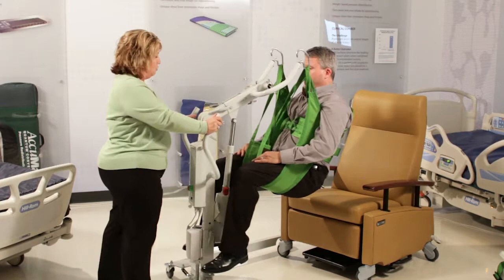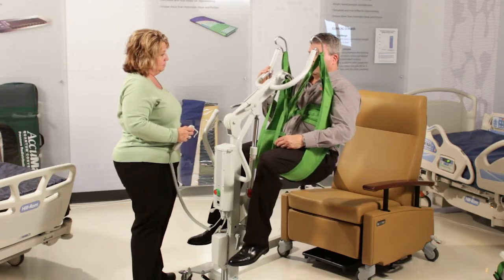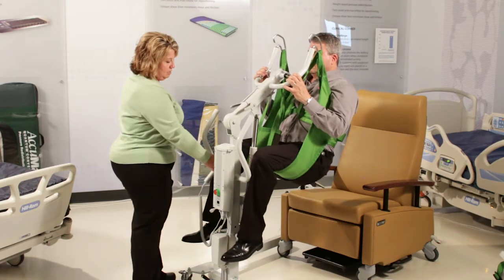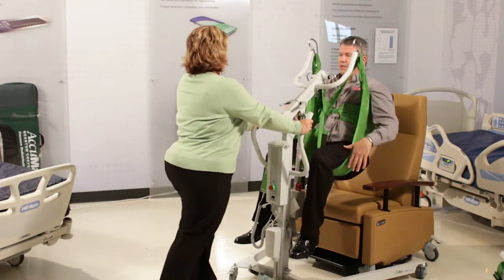Go to the bathroom? Correct. Are we going higher, or is this about as high as this goes? It just brings you closer to the loop. But we've got plenty of clearance to get you back into a chair or onto a bed. As long as you can sit on the side of a bed, you can get into this position.